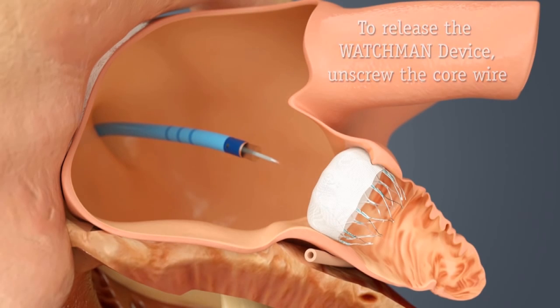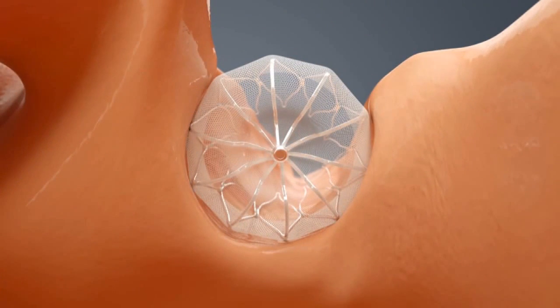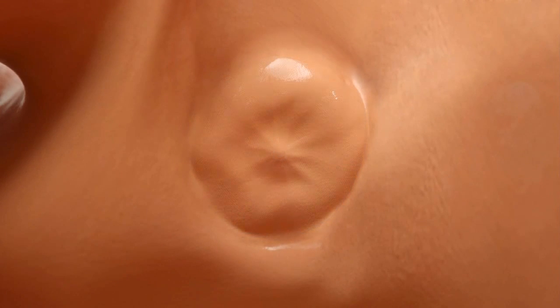As mentioned, the device is tethered the entire time. If we feel comfortable with the position, there are no leaks and it's well positioned, we release it. At this point, the patient is able to go home the following day. They are on Coumadin for approximately 30 to 45 days, at which point we get an echo, and if the device looks good, they go down to a baby aspirin and Plavix per day for a total of six months, and then just down to a baby aspirin.